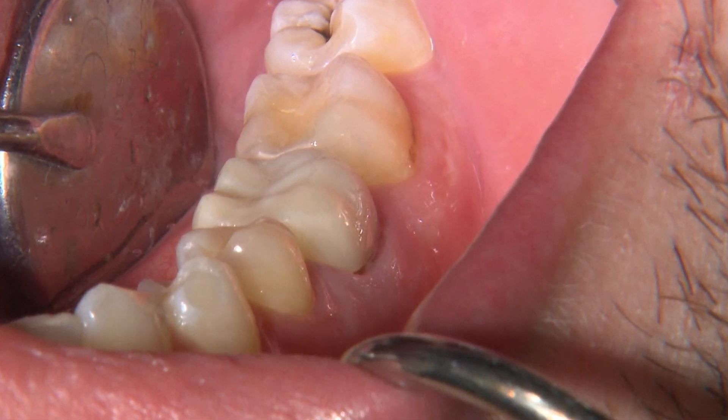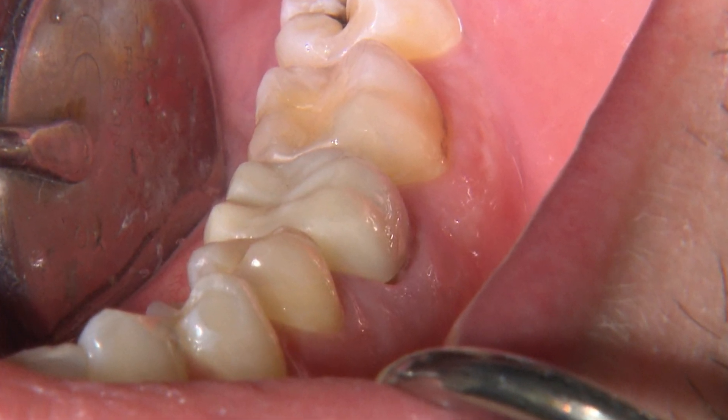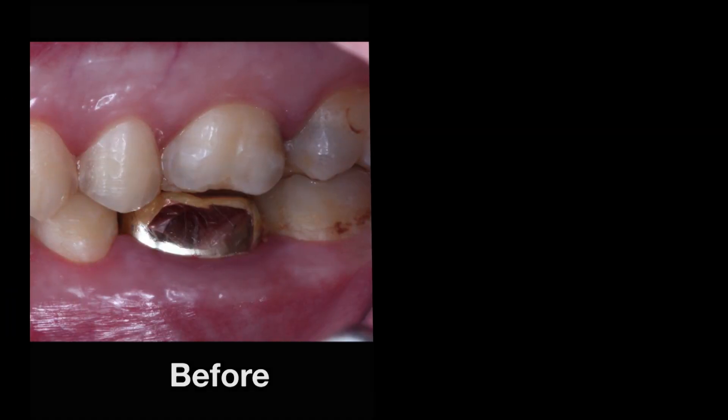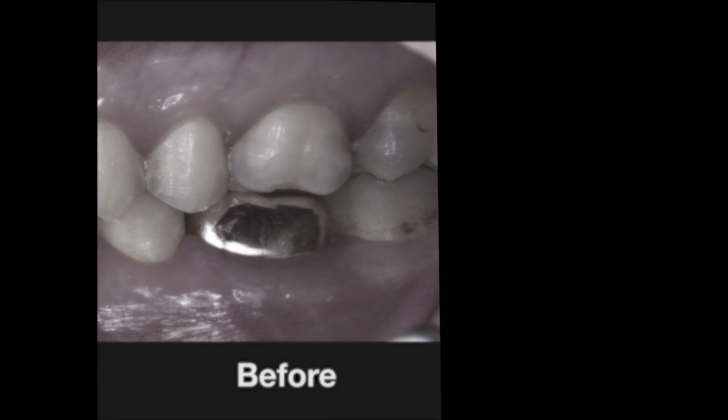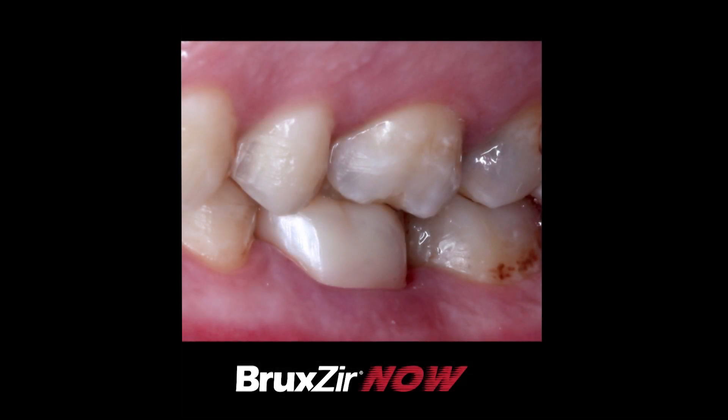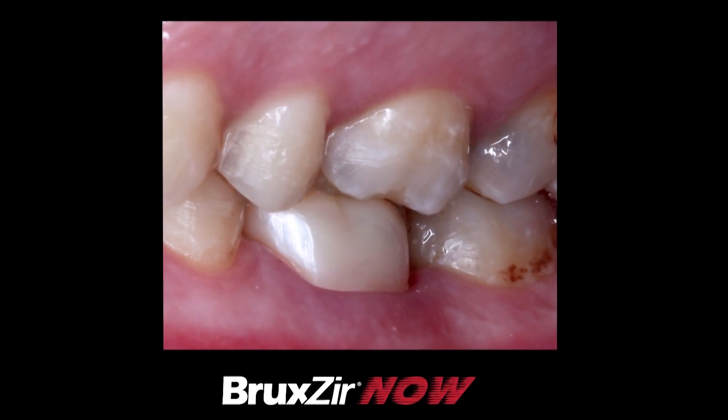With this amazing chairside technology, in less than 50 minutes we were able to capture our digital impression, design, and mill a fully sintered monolithic zirconia crown. I'm always so impressed with the speed at which we can deliver the strongest restorative material we have in dentistry without any compromise in quality and fit. Thank you for your time.